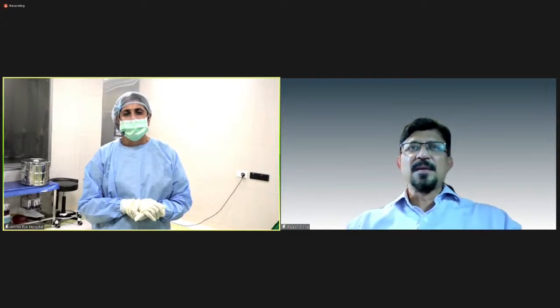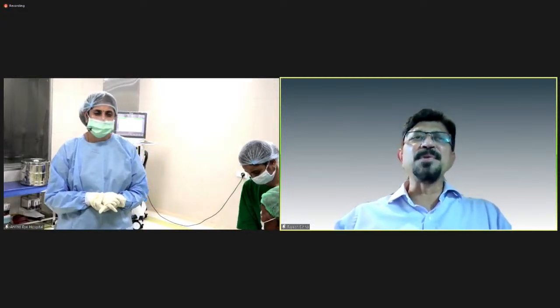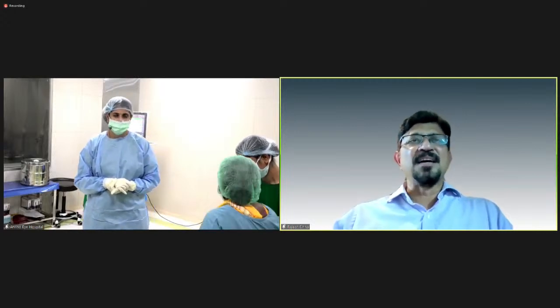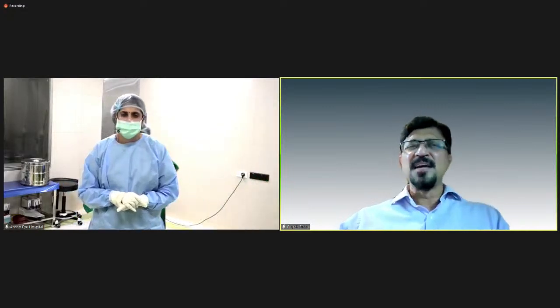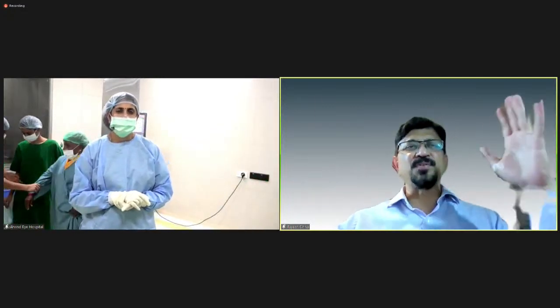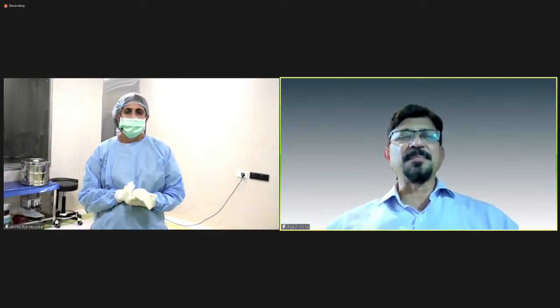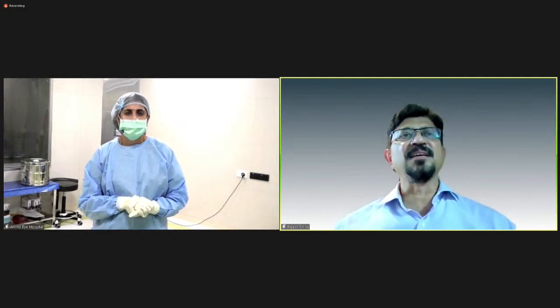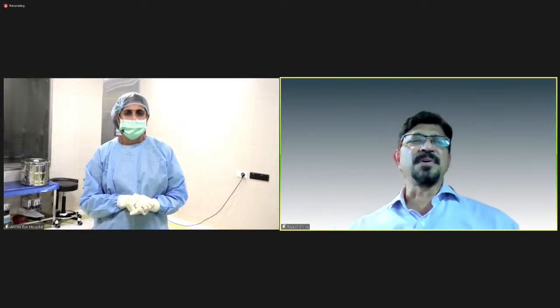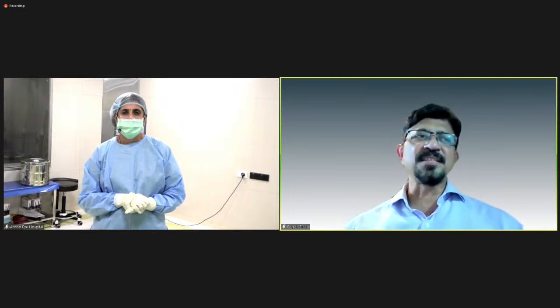Yeah. And it was really wonderful because every time we have your Surginar, there is some new tip that you give to all of us. And the one that you gave in cases of myopes, that you lift the iris, really showed in the case, because we could see that the AC was not getting very deep, and the patient definitely will not have any symptoms. That was a really wonderful tip, apart from the wonderful surgeries that you showed. Very smooth and very nicely done.